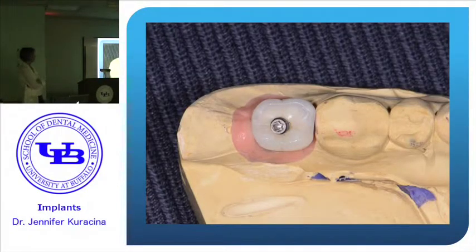Be particularly careful if you're trying in a screw-retained restoration, if you're like me and don't do these a whole lot. I was getting lazy. This is one of my own cases, and I didn't want to have to screw that thing in every time I tried it in to check the interproximal contact, so I left the screw out and I'm adjusting and I think I got it, and then I said, okay, I'm going to screw it down and just do a last check. Well, I had opened the contact too much, and it doesn't look like it, but I had opened it, so I had to send it back to the laboratory. So it's kind of a pain, but you should screw the thing in every time you try it in and check it.